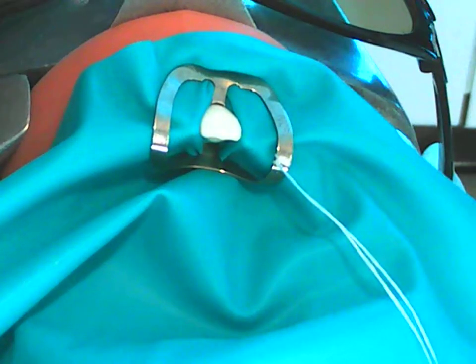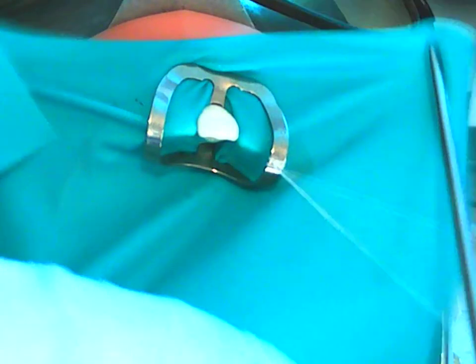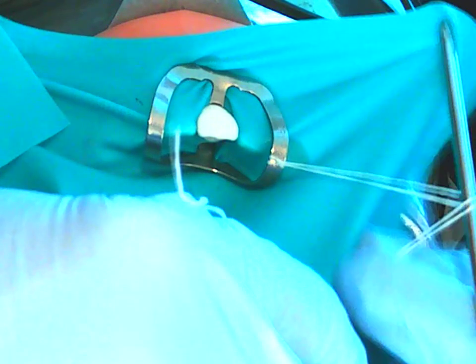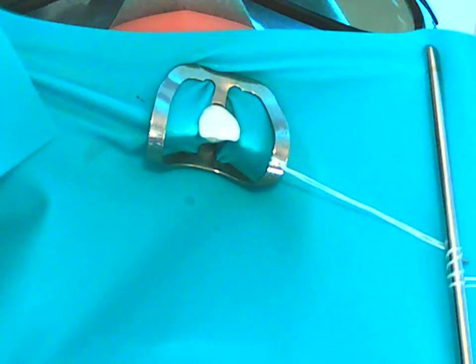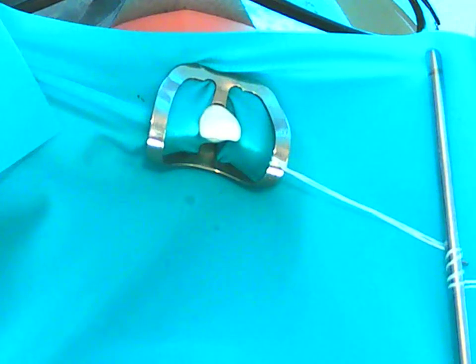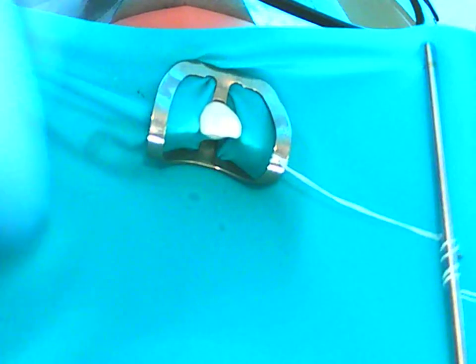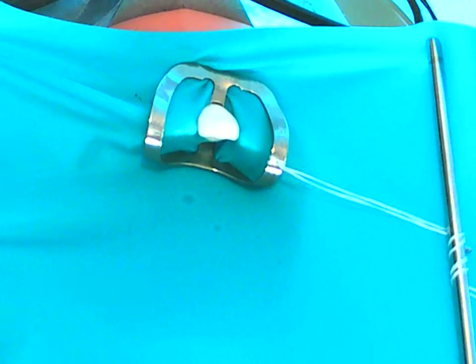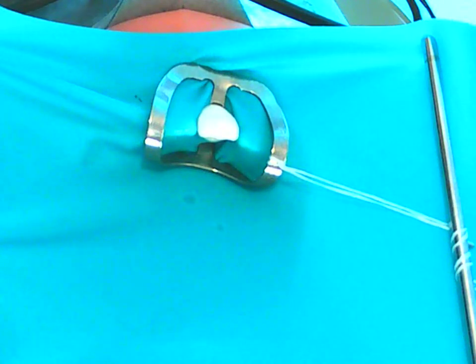Okay, and now you basically put your frame on. Okay, I'm securing the floss to the frame. Okay, you don't have any of the steps. There's no ligature, there's no inversion process. So you simply go into the stretching of the dental dam over all the prongs on your frame, and you are complete with the application.